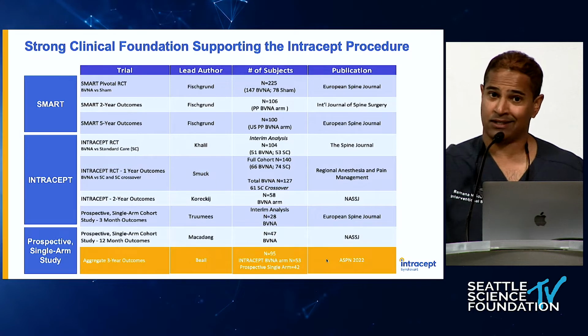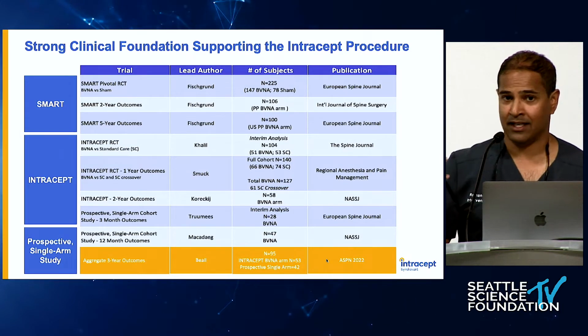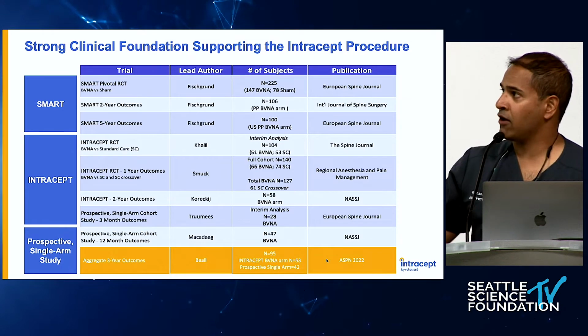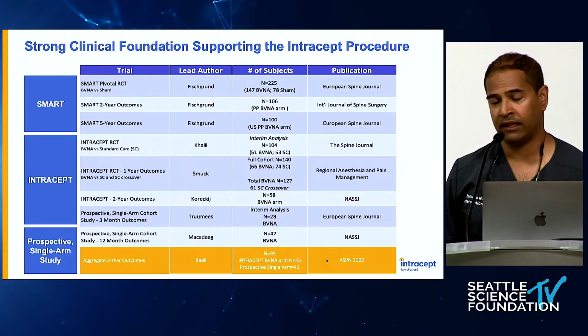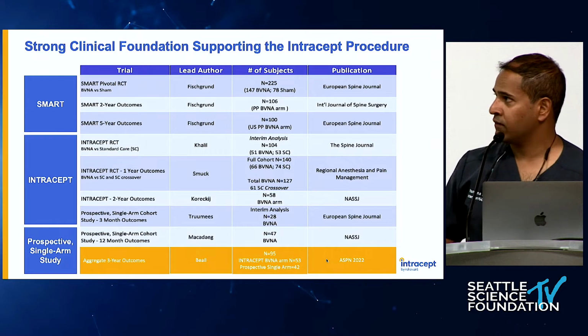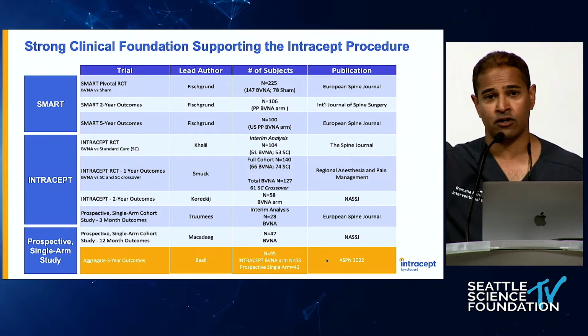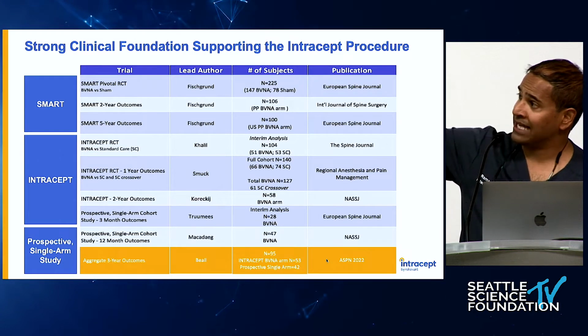So this is actually a 6 to 7 year follow-up study, and that's one of the reasons why we say it's basically a one-and-done procedure. We would expect with many other RF technologies for the pain to return, right? Sort of that dip, the nadir, and the return of pain like we see with the medial branches or even the geniculars. That's not the case with this. In fact, the outcomes are even better at 5 years than they were at 2 years or 1 year or 6 months.